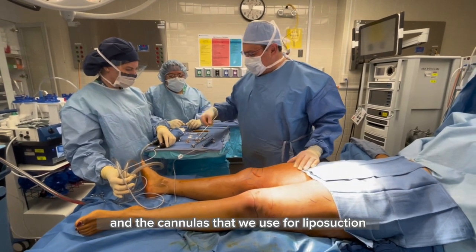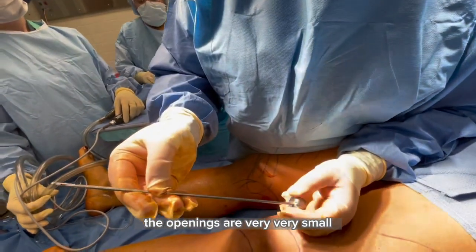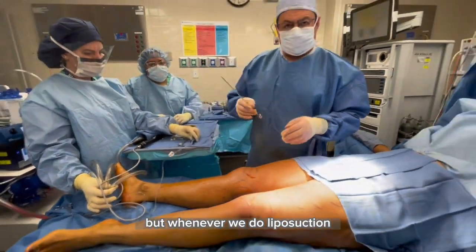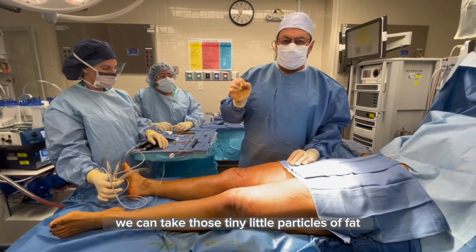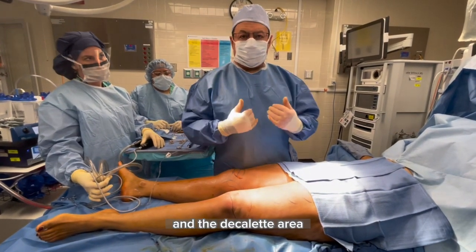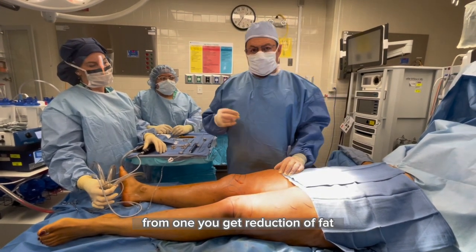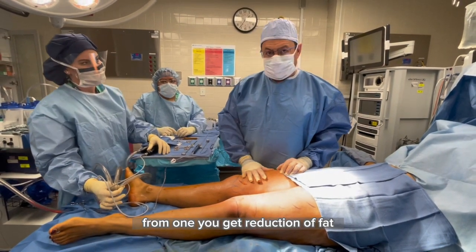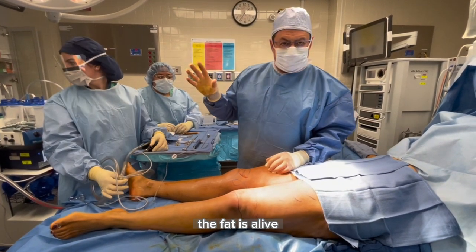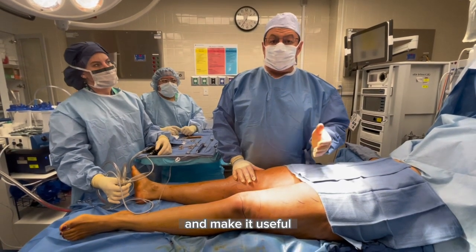The cannulas we use for liposuction are also different — the openings are very, very small. Whenever we do liposuction with a VASER, we can take those tiny little particles of fat and inject them in the hands, in the face, in the décolleté area — wherever there are wrinkles we can use that. So you get two from one: reduction of fat, but we also keep the fat alive. For about a couple of hours the fat is alive; we can wash it out, clean it out, and make it useful.